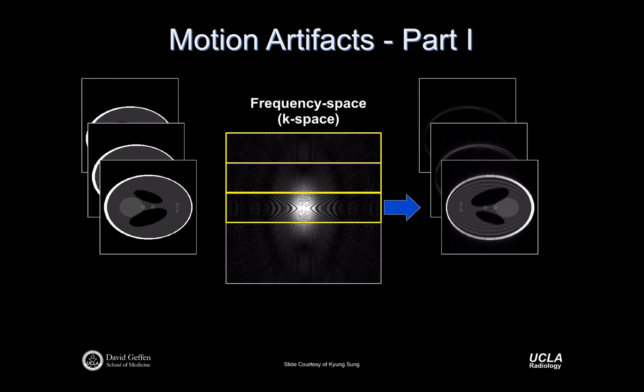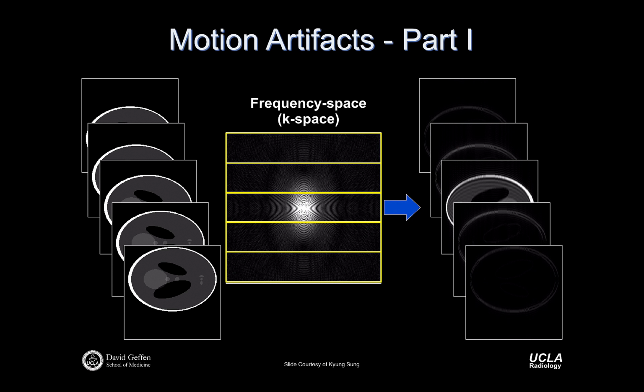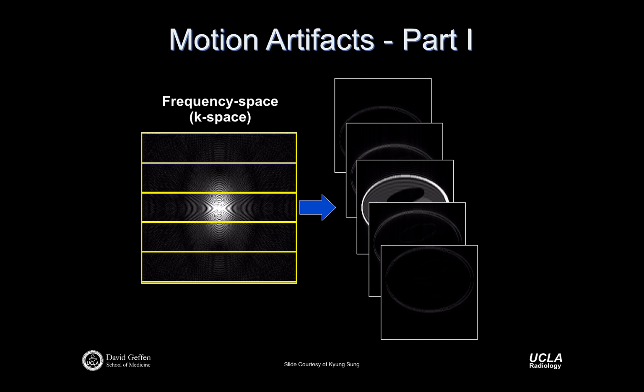We get the middle of k-space. Here now you do actually see some Gibbs ringing in addition to, well, there's not much of a motion artifact there, just the Gibbs ringing. And we can step through the other blocks. And the point is that what that final composite image looks like is basically the superposition of these different sub-images. Right? It's all a linear transformation through the Fourier transform. We're basically adding those features together to give us that final artifact image.